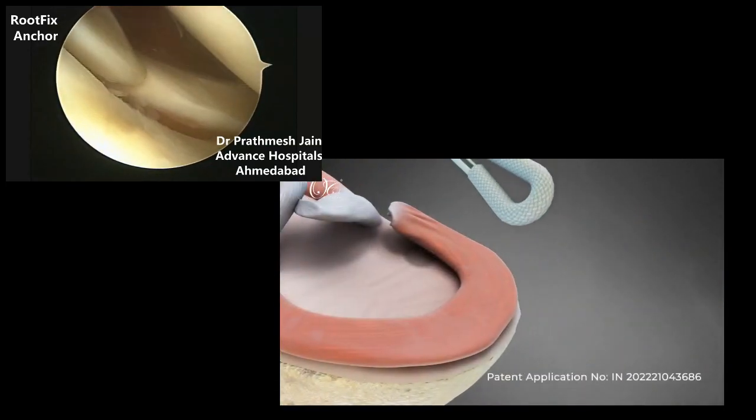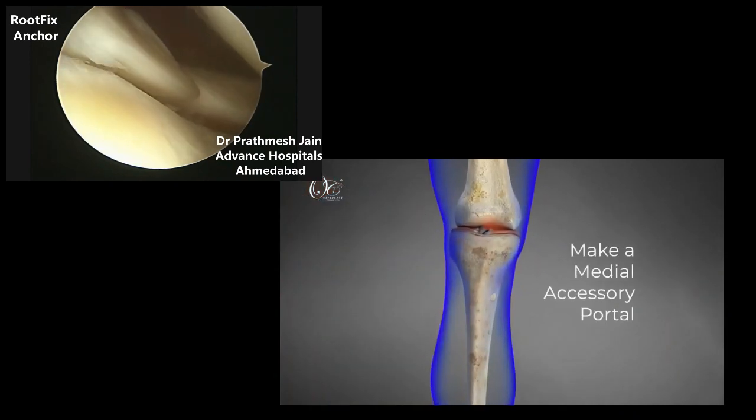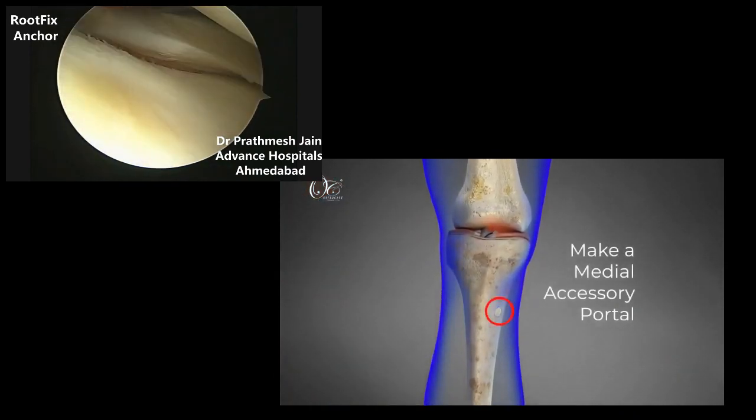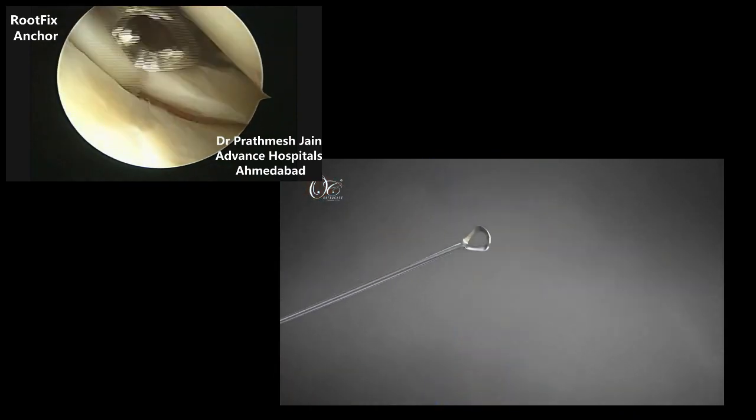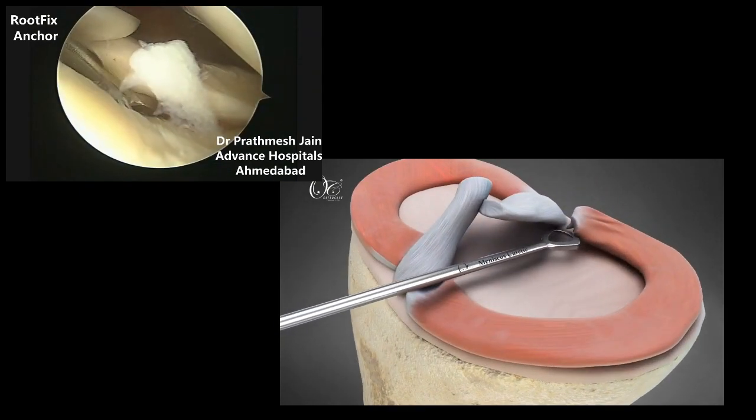Medial Meniscus Root Tear Repair with a novel technique using the Root Fix Anchor. Make a medial accessory portal, anteromedial to the tibial tunnel. Debride the tibial cartilage with a meniscus curate, and prepare the bed through exposure to subchondral bone.